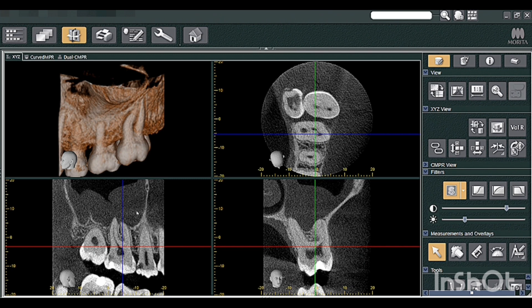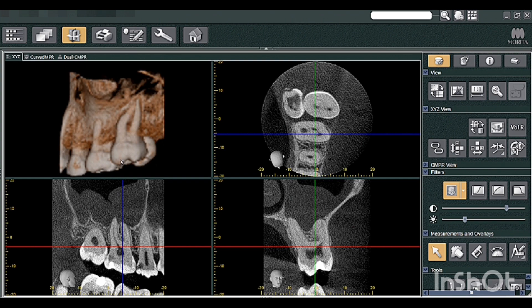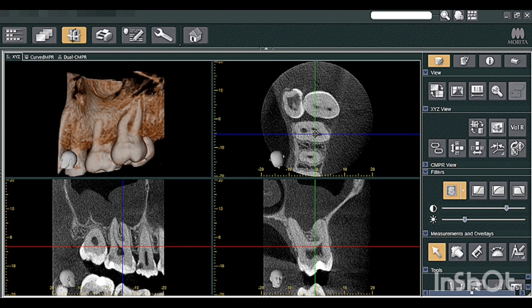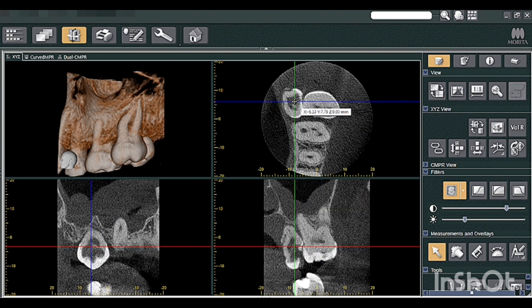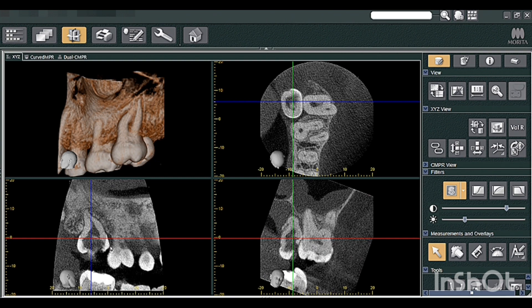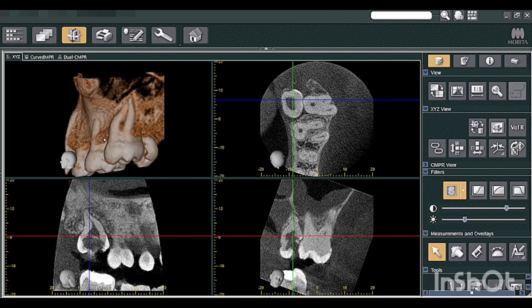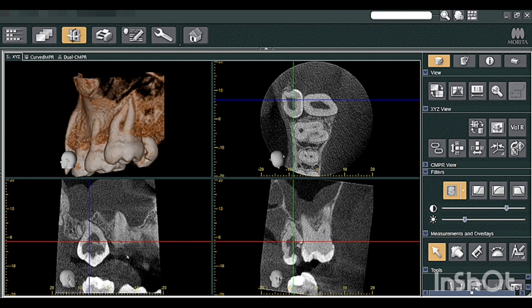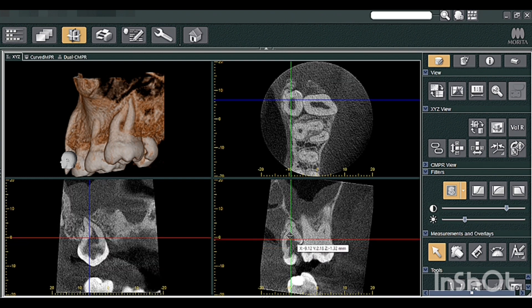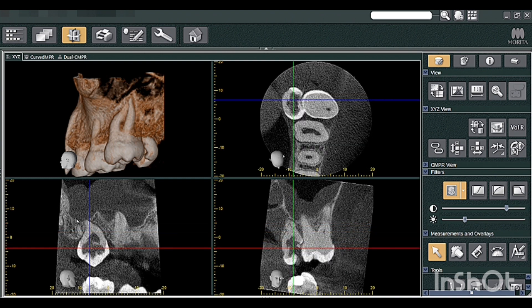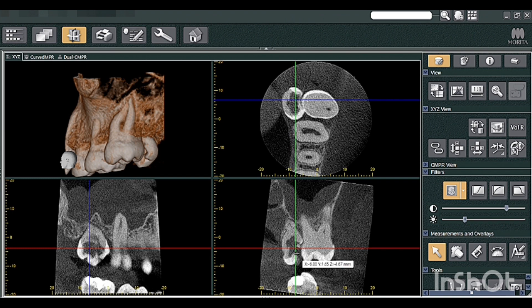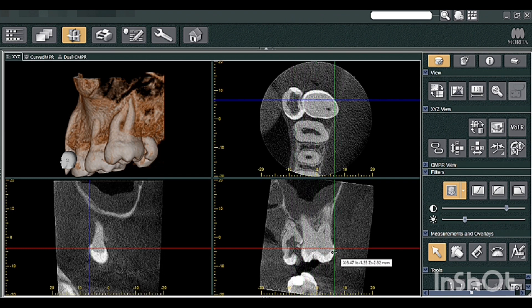As we've seen the panoramic view, we took the CBCT of this specific region — the second quadrant. Have a close look at the tooth of concern. You can get the lines along the tooth of concern and arrange it along the long axis of the tooth. Basically, this is your third molar which is palatally placed, vertically impacted, palatally erupted, grossly decayed, and the root apex is in contact with the sinus floor. You can check the sinus floor — sinus pneumatization is also evident — by moving from buccal to palatal.